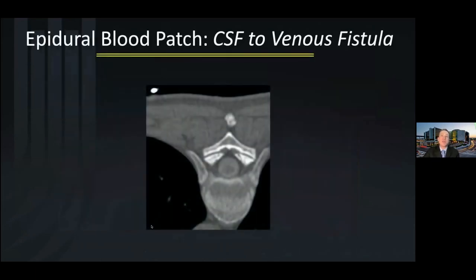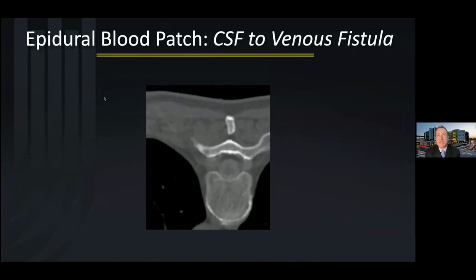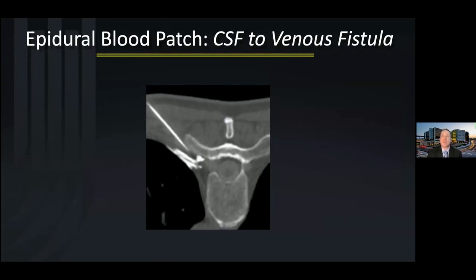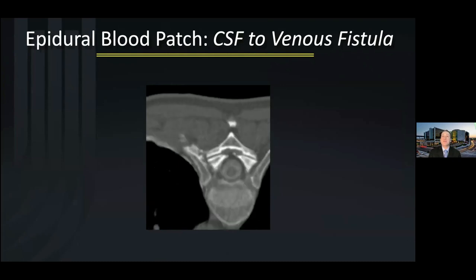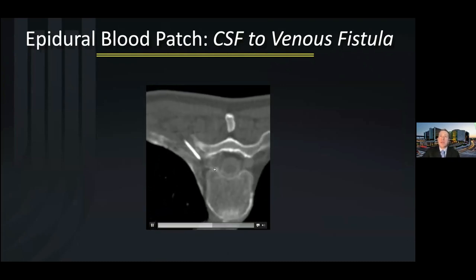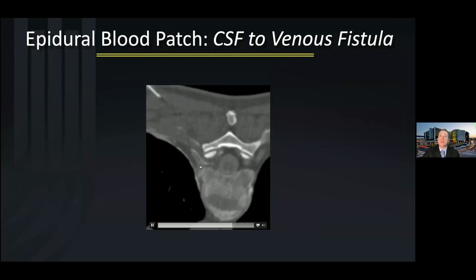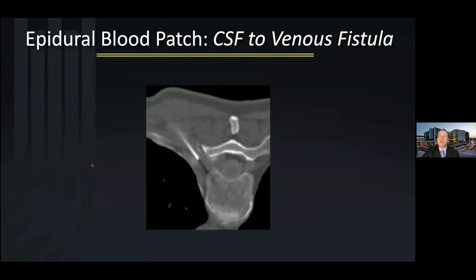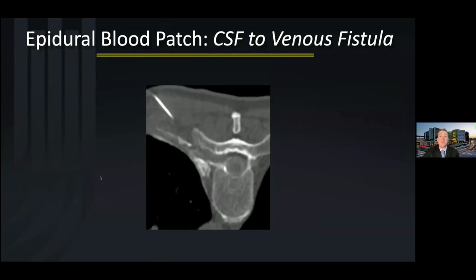And this was the treatment video for this case. Here we're making an approach that's actually quite analogous to what we just did to treat that nerve root sleeve diverticular leak. But here we're trying to target also where the fistula arises from the nerve root sleeve. You're going to see the needle placement comes out laterally, and we're trying to get excellent spread of patching material in and around that area, because you can see some of these more anterior approaches here. Dr. Mamluk is going to talk about his center's approach and how they treat some of these fistulas later.